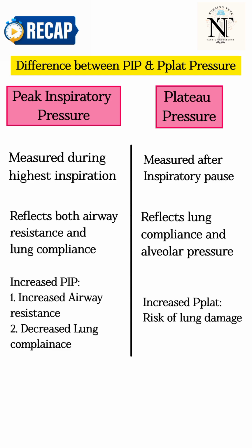I hope now you have understood the difference between peak inspiratory pressure and plateau pressure.